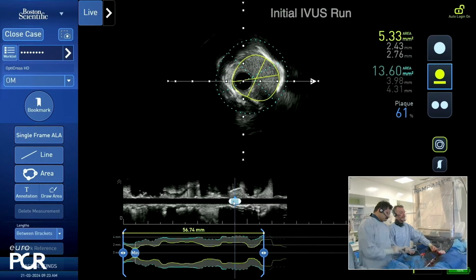The first one, obviously, you haven't seen on the screen because in the interest of time, it was trimmed down by the colleagues, is that the IVUS catheter did not manage to cross. They tried, but it did not manage to cross. So with this, there is an additional challenge. We have seen that the workhorse wire was into this marginal branch. Not even the microcatheter could make it to go distal. And this is not an uncommon situation, right? So I would like to hear around the table, what are your tricks to get at least the rotor wire down, when not even the microcatheter can cross?